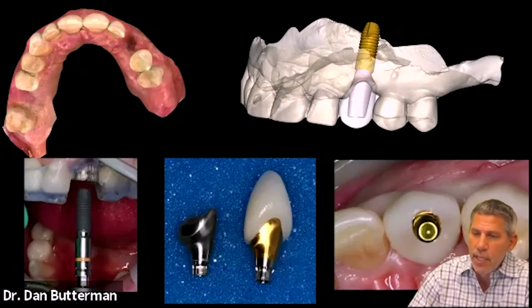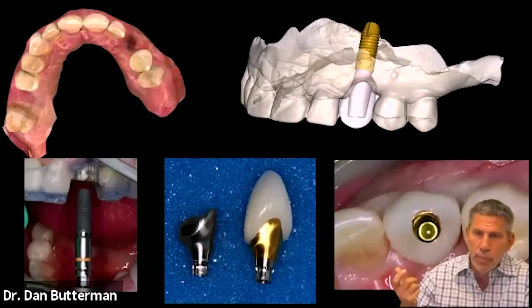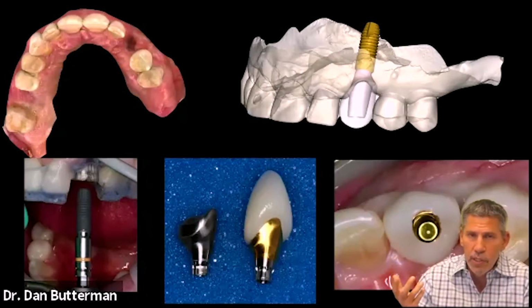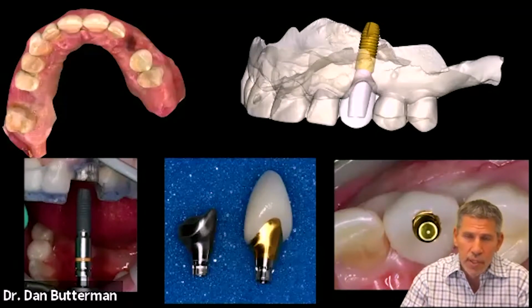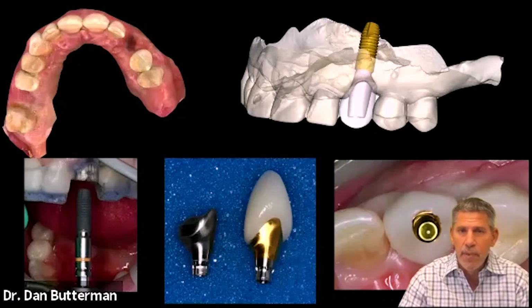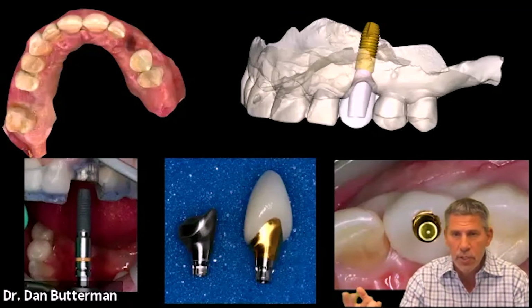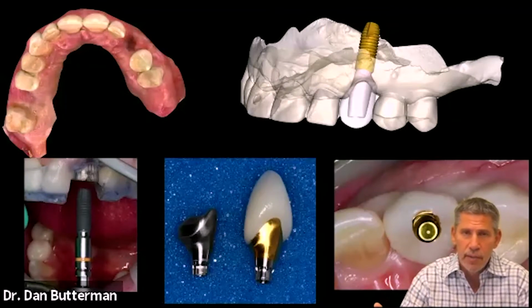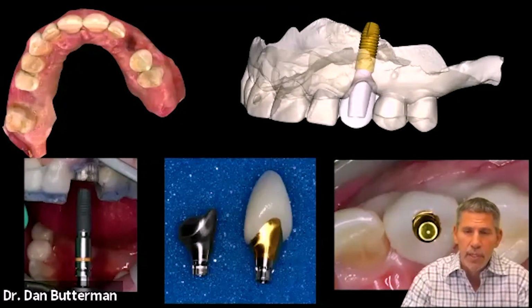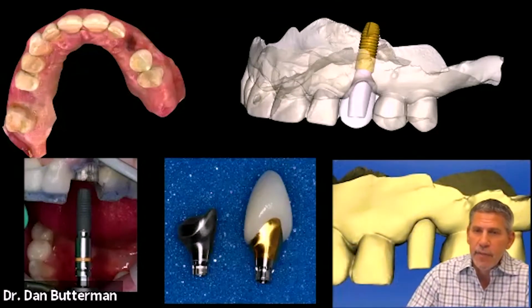So the patient leaves, and this is literally just picking up the temporary and the final abutment and screwing it into place. Those of you that have made temporaries at time of surgery know that just making the temporaries is going to take you longer than the implant surgery by far. That's a major reason why we may not want to temporize it. That's why a lot of times we're using flippers and Essex retainers. Of course, there are other reasons as well, but that is certainly one. So if it's just sitting on my tray, that's a great ability to be able to pick it up and use. So the patient leaves, and then as part of this, I'm going to have the virtual abutment.